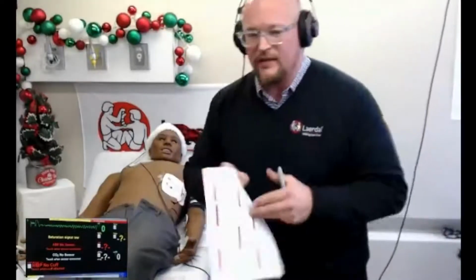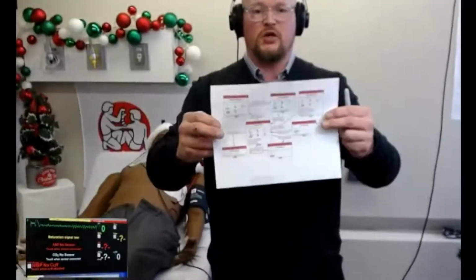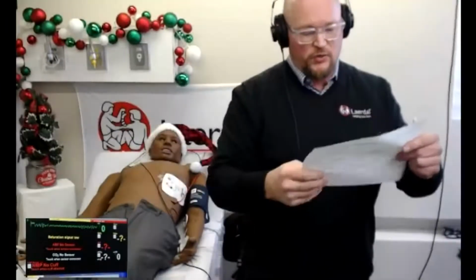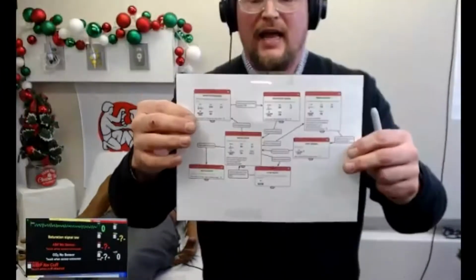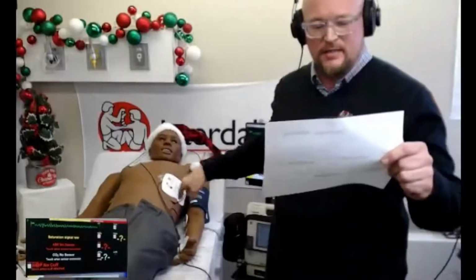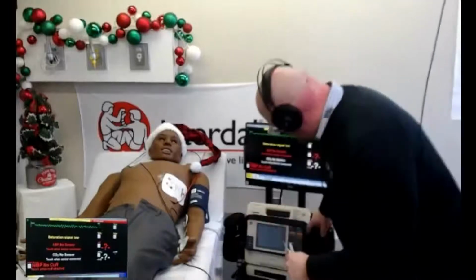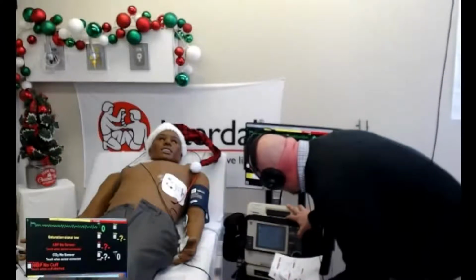And here's another thing I'd really like to point out. When you design scenarios in Leap, it's always good to print off a map, and that map is available in Sim Designer. If you hit print, you can save it as a PDF or print it off. And now I can see that I'm in VFib arrest, and I actually made an error. I don't have the mannequin going from VFib arrest back into normal sinus rhythm. I'm going to try to shock him one more time, because I do see that if I shock him at 200 joules, it should go back.